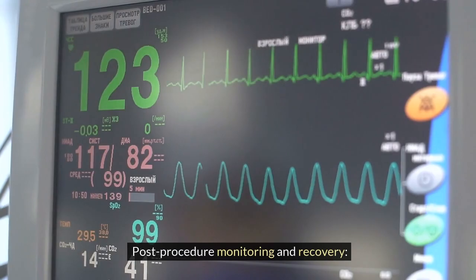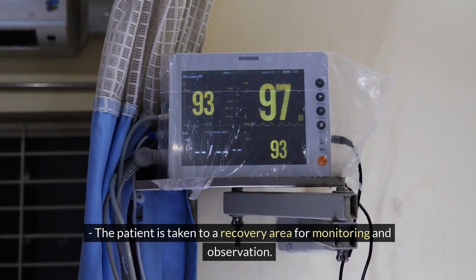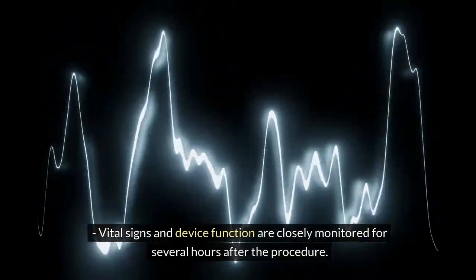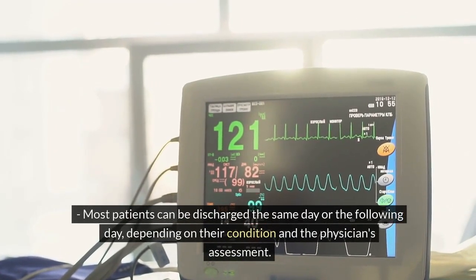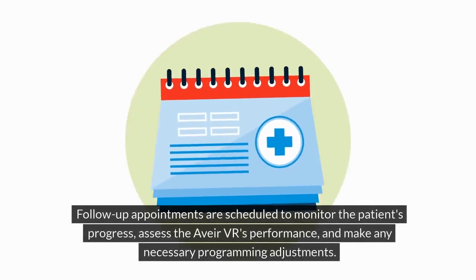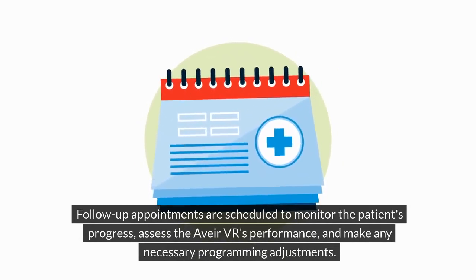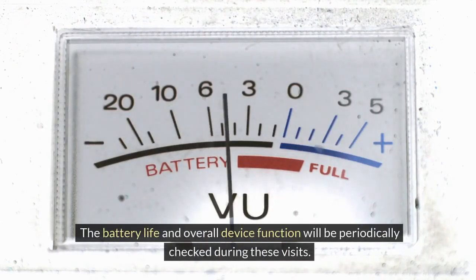Step 7: Post-procedure monitoring and recovery — the patient is taken to a recovery area for monitoring and observation. Vital signs and device function are closely monitored for several hours after the procedure. Most patients can be discharged the same day or the following day depending on their condition and the physician's assessment. Follow-up appointments are scheduled to monitor the patient's progress.